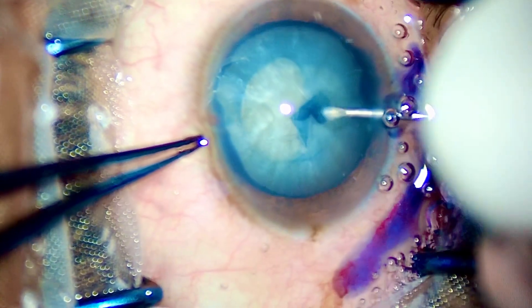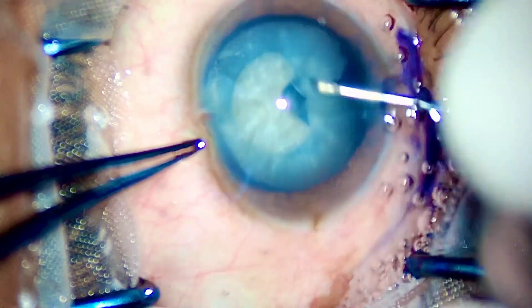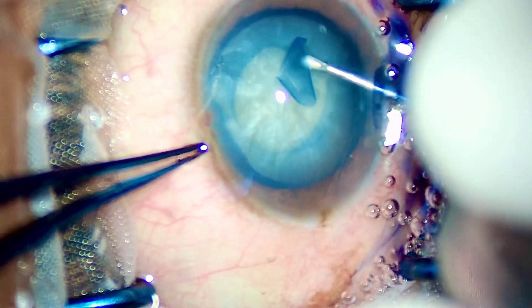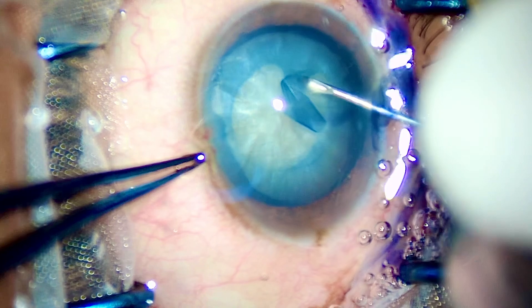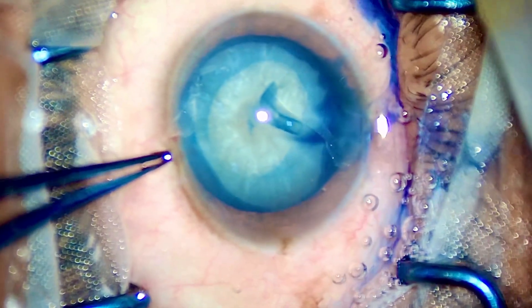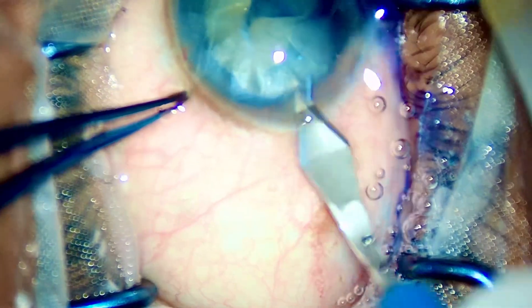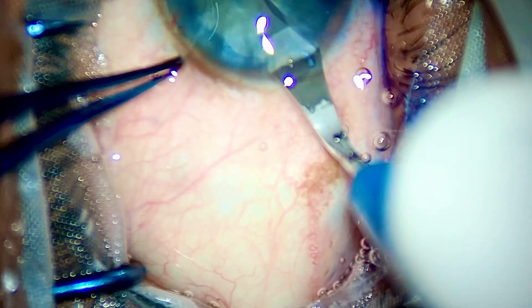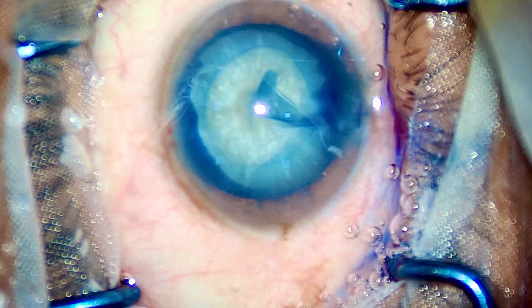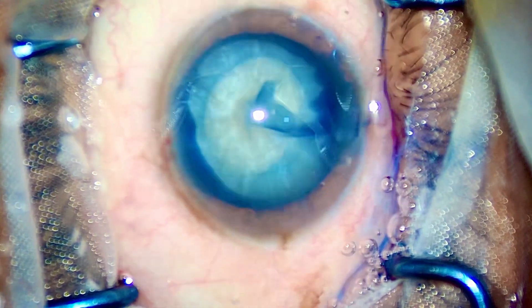Starting with the case, I have made two side ports and I have started a decently sized rhexis. It is not a big rhexis, but it is adequately sized — it is 4 to 4.5 millimeters. It would have been a little bigger and I would have been more comfortable if it were in the range of 5 millimeters, considering the hardness of the cataract, but nevertheless it's a good sized rhexis.